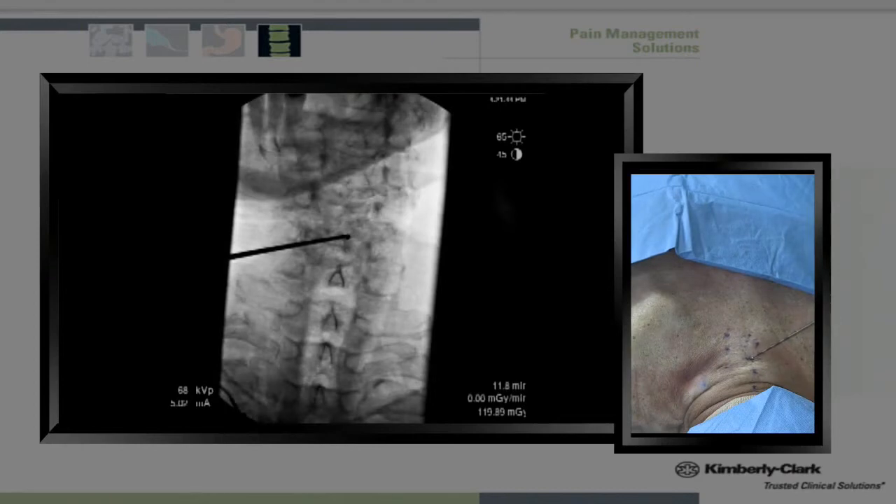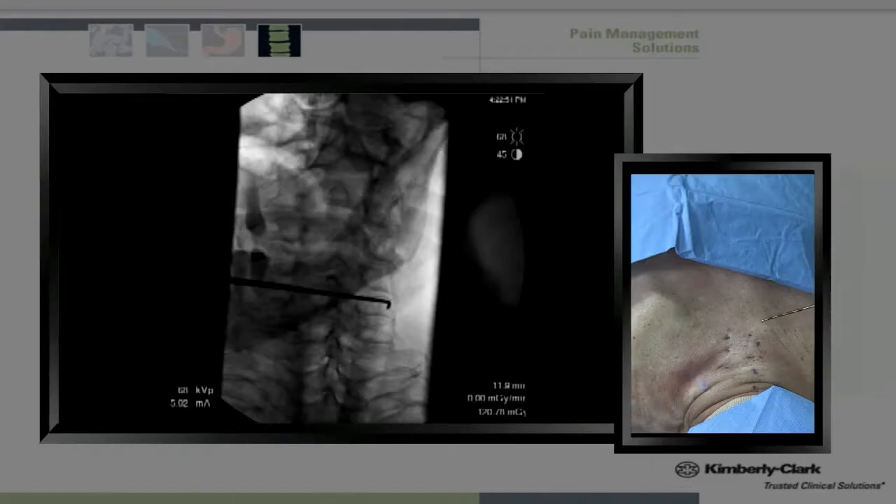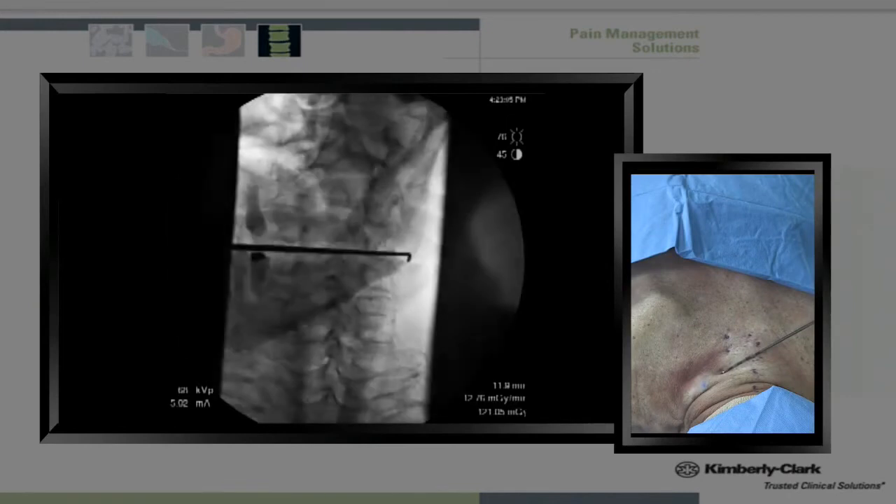Thus, we will give ourselves approximately a 20-degree caudal tilt. This caudal tilt then demonstrates our pillar view. Here is C6, C5, and C4.